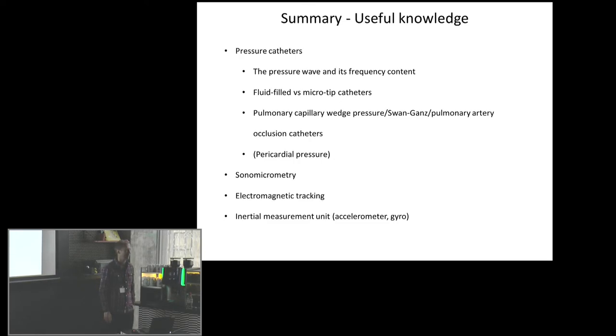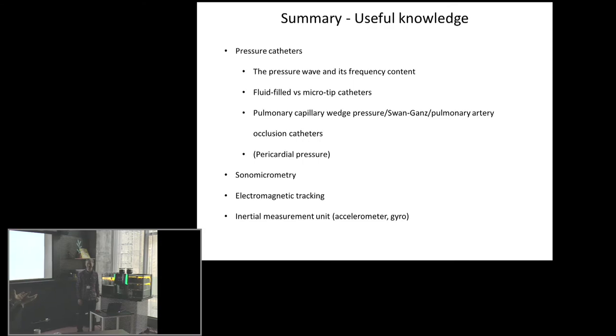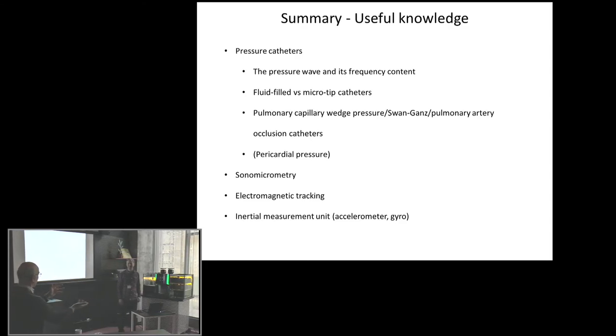Questions? I have at least one comment about the crystals. Yes. Because they seem very experimental, but there's nowadays a new mapping system with 8 splines, which is now being put into the left atrium for ablation purposes, where they have 48 electrodes and 48 sonomicrometer crystals, which is meant to measure basically the size of the atrium, nothing more. And then with the electrodes, they extrapolate to the wall of the atrium to get electrical maps.